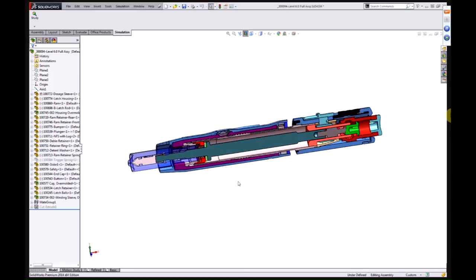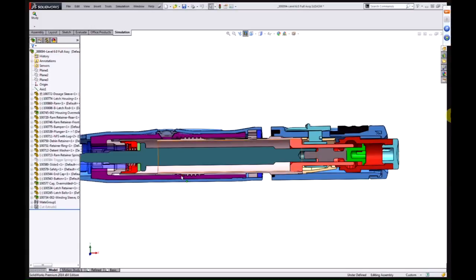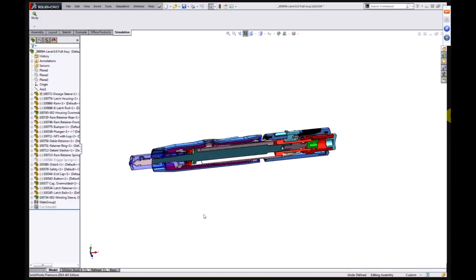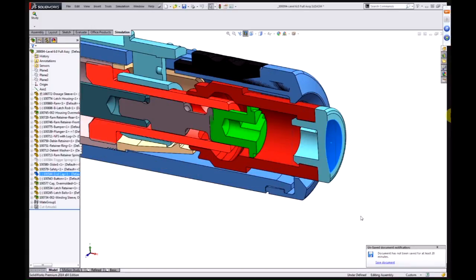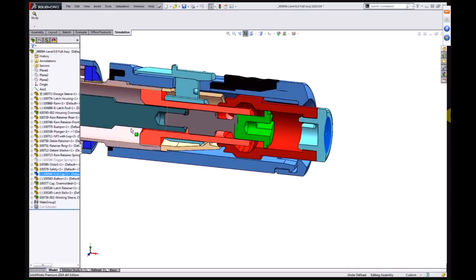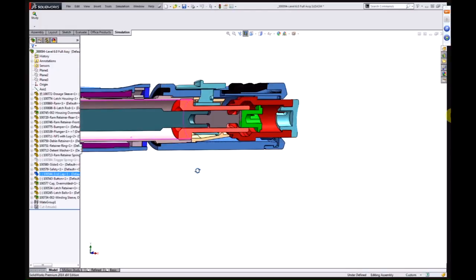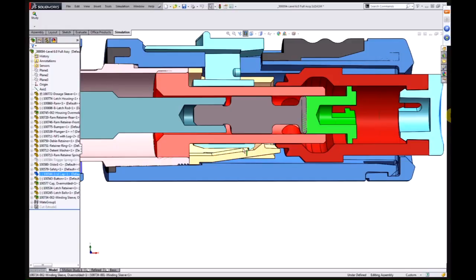And linear static stress analysis allows us to go in and apply loading to each one and evaluate the stress levels. For example, we could apply a thumb or an actuating force to the top here and see how that develops stress in all the walls as it goes down. Now, the one I've chosen to look at here is a clip fit between these two parts, so that when you compress the object, when you actuate it, it has a satisfying click into place, and then there's a twist action to reload the next dose, which causes it to pop out.